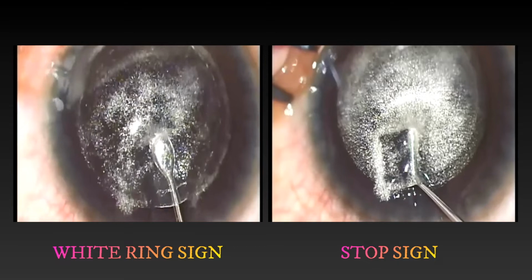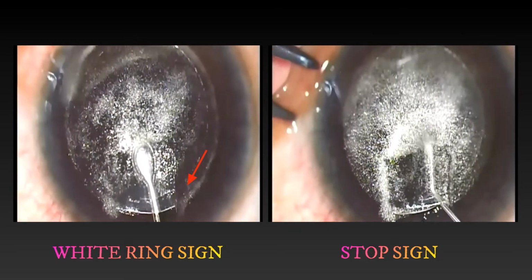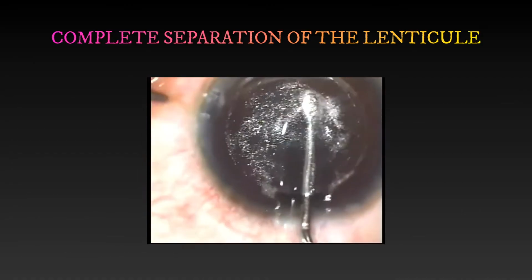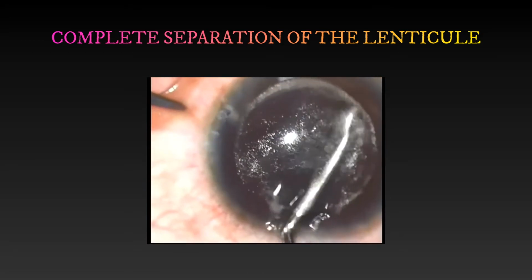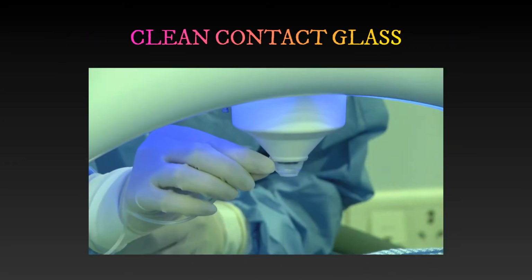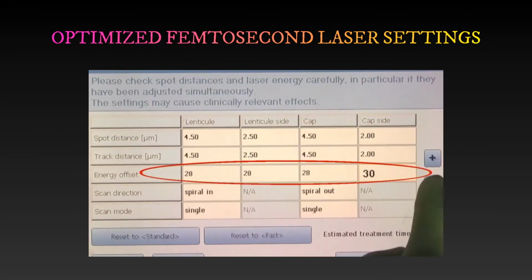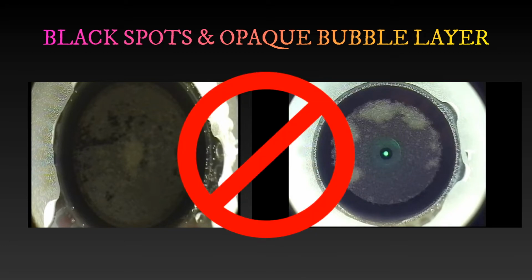The white ring sign and the stop sign described earlier should be observed for accurate identification of the lenticule planes. Complete separation of the lenticule from both the planes as well as the side cut while avoiding excessive side-to-side movements must be employed. Corneal surface moisture should be optimum, contact glass should be clean, and femtosecond laser energy settings should be well optimized to prevent black spots or OBL.